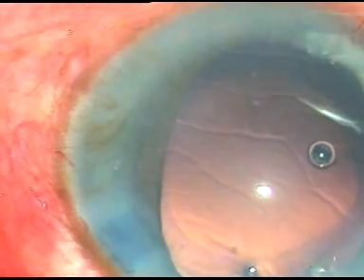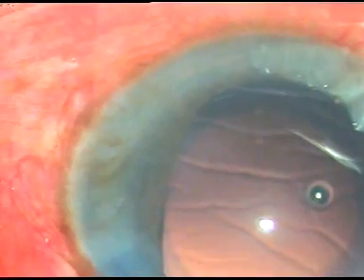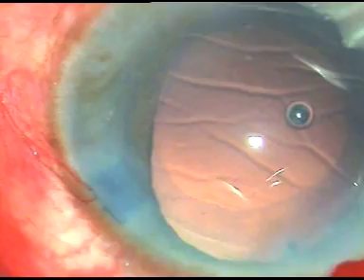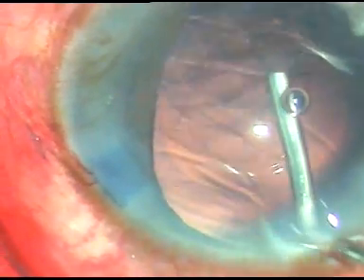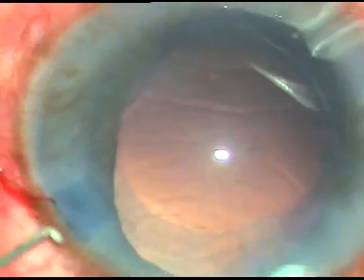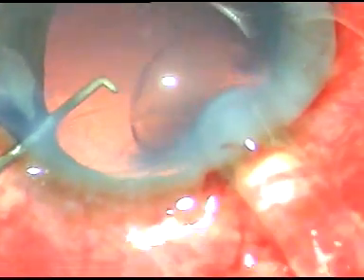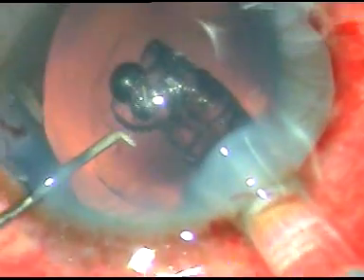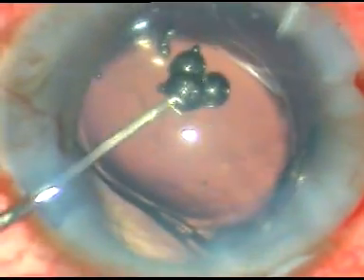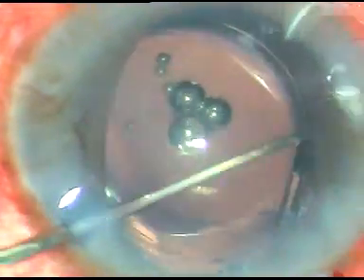Now I inject viscoelastic substance, that is HPMC, into the antechamber and inside the capsular bag. Here it is. HPMC is injected into the antechamber and it inflates the capsular bag. Now this is a hydrophilic acrylic intraocular lens being implanted in the capsular bag. The leading haptic has gone into the bag and see the trailing haptic. It is depressed with the chopper and it goes into the capsular bag.